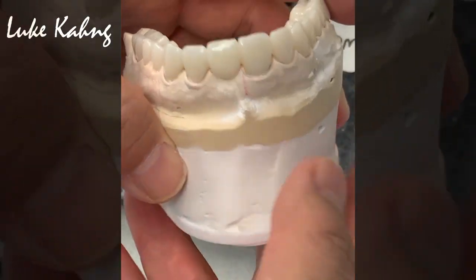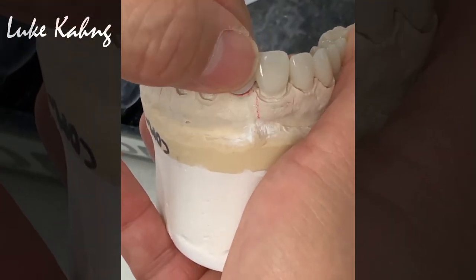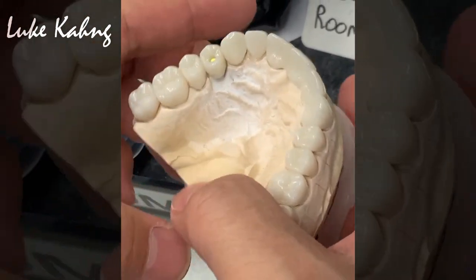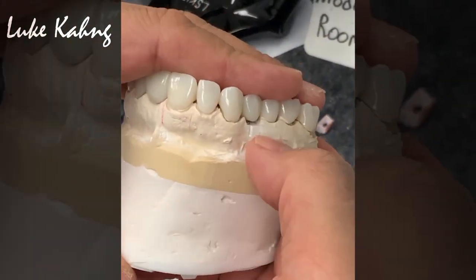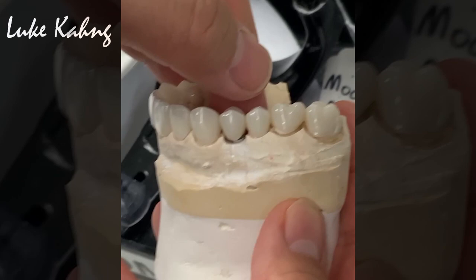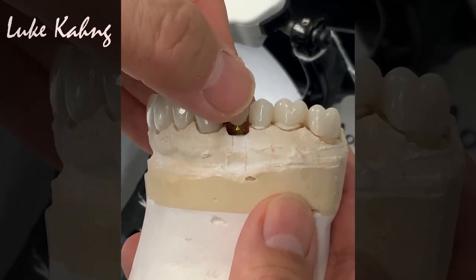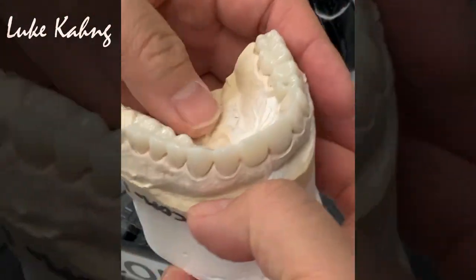Then this is the upper. We designed it the same way. Remember, we made the 4-unit bridge on top of that, and they make the beautiful contour, and then we made a great buccal corridor for this, so screw it in, which is great, just like that. After we polish it carefully, we anodize it just like our technique, like this. Then we're going to cement it, so it will be one piece. We make it for cosmetic reasons for facial.